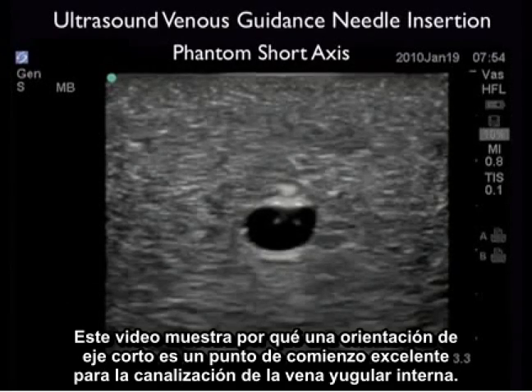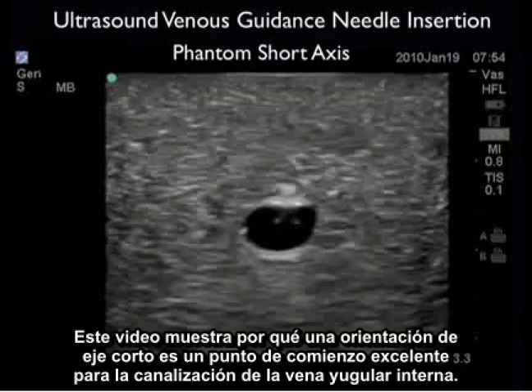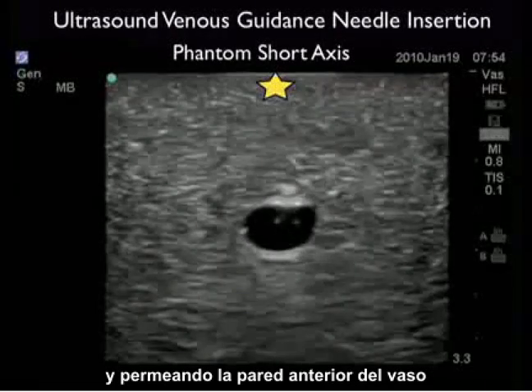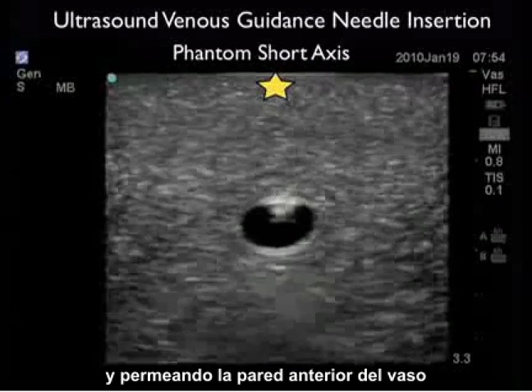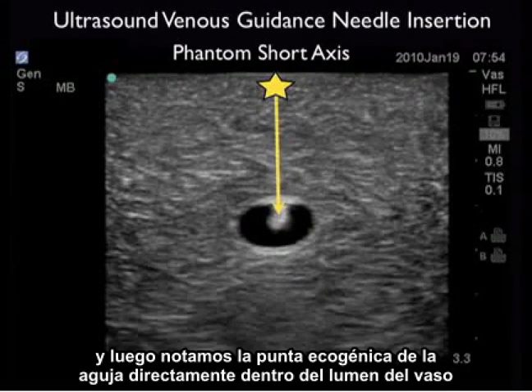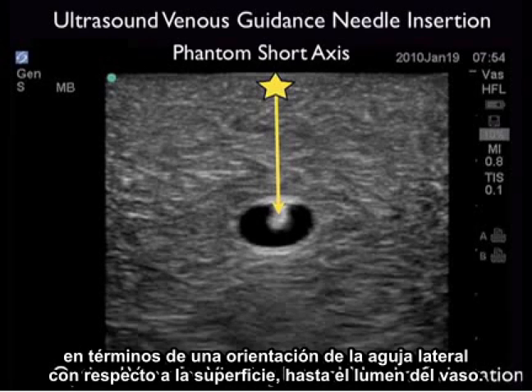This video clip shows why a short axis orientation is an excellent starting point for cannulation of an internal jugular vein. Here we see the echogenic tip of the needle coming down and permeating the anterior wall of the vessel, and we then note the echogenic tip squarely inside the lumen of the vessel. We can see how the short axis orientation guides us in a side-to-side orientation on the patient's neck in terms of lateral needle orientation with regard to the vessel lumen.